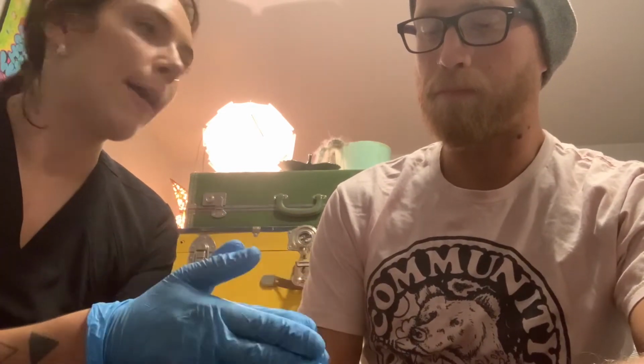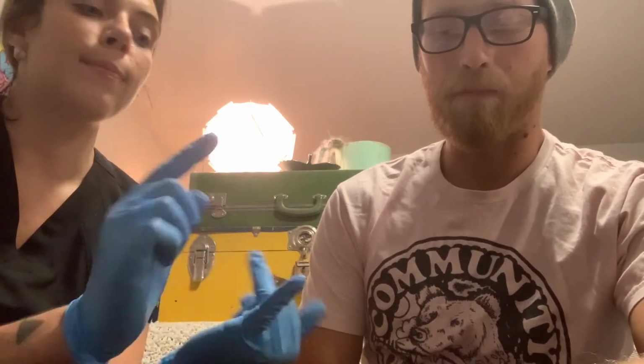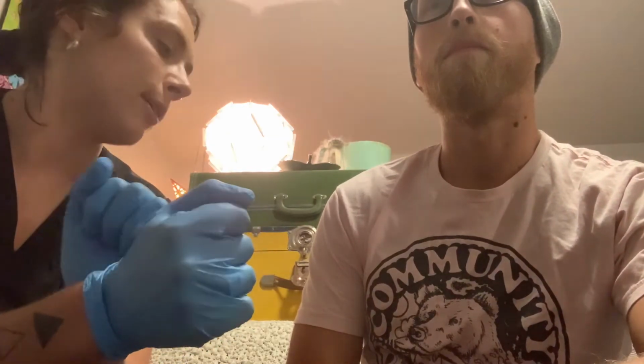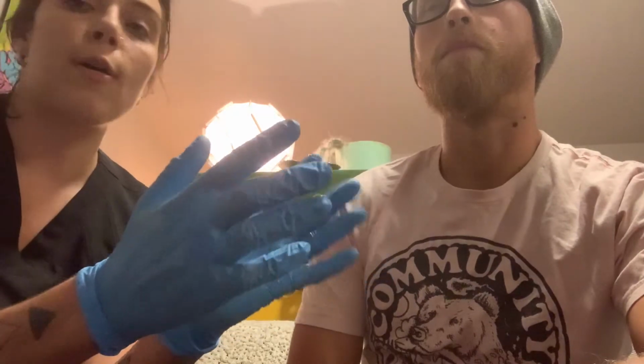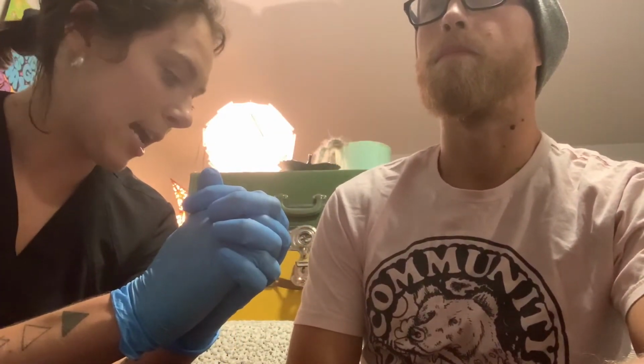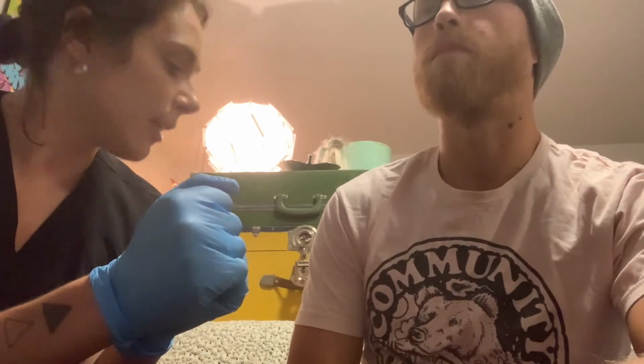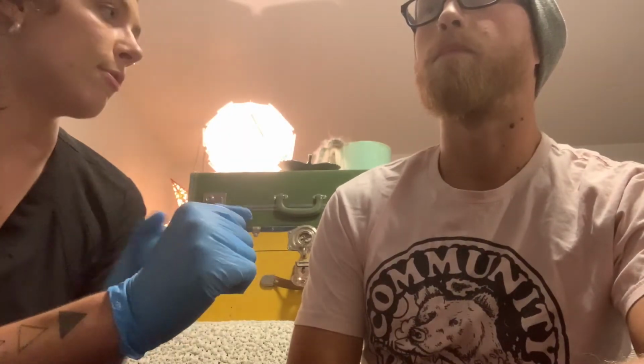So as usual, I would go into the room and introduce myself, check for my 2 patient identifiers, and I would be making sure I was explaining the purpose of the intravenous therapy and the process for which we are going to do that. I would have already primed my IV tubing at this point, and I would make sure that I had performed hand hygiene, applied a fresh pair of gloves, and at this point I would begin to assess for the vein.